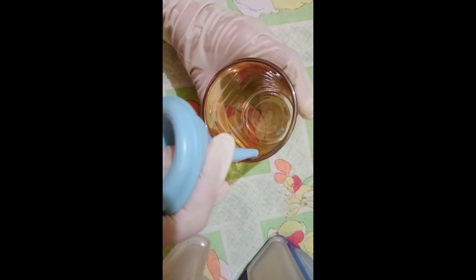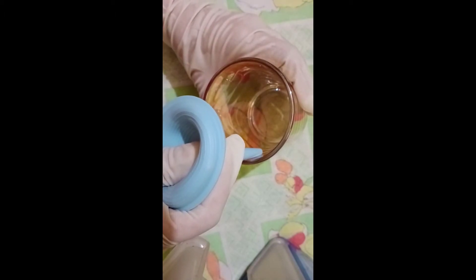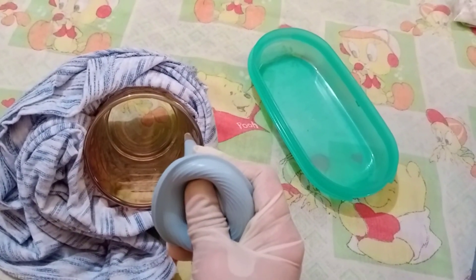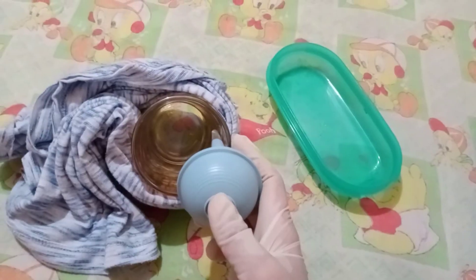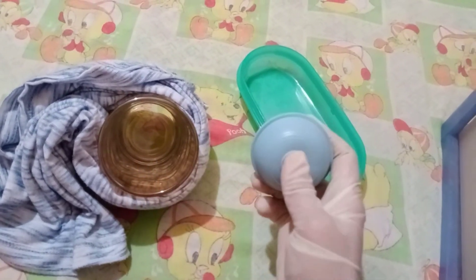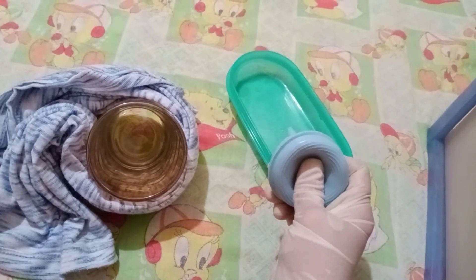Assuming that this glass represents the mouth of the baby or the infant. Gently insert the tip of the bulb syringe into the dependent side of the newborn's mouth to collect drainage. Release the compression on the bulb to allow for expansion and collection of secretions. Remove the bulb syringe from the newborn's mouth and gently squeeze the bulb to release the collected drainage into the appropriate receptacle or onto a tissue.